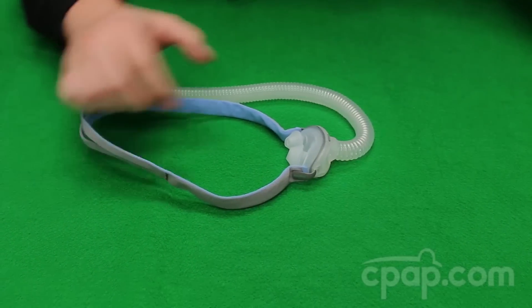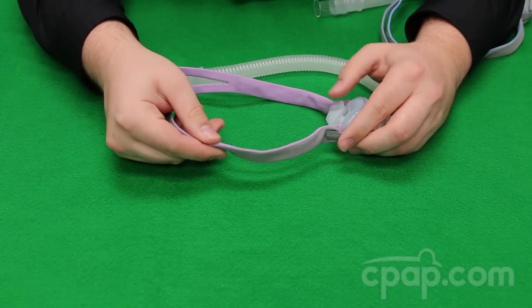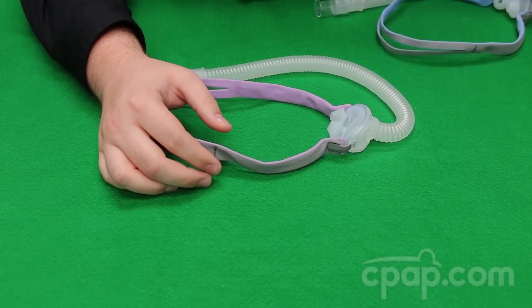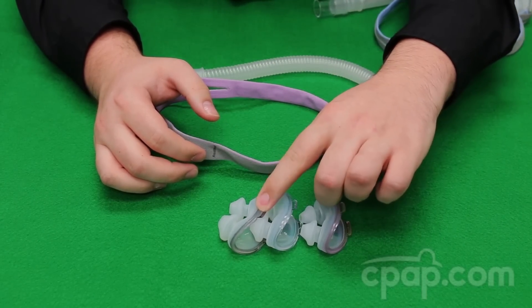Alternatively, there is a For Her version of the AirFit P10 which features a pink and gray headgear. It also comes with three sizes: extra small pink, small clear, and medium gray.